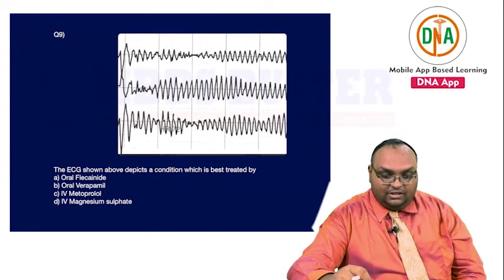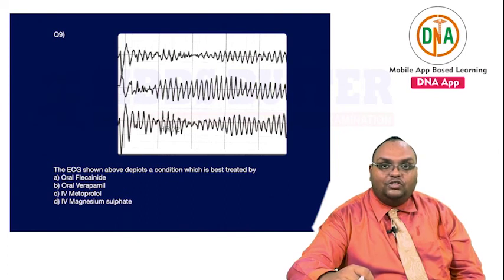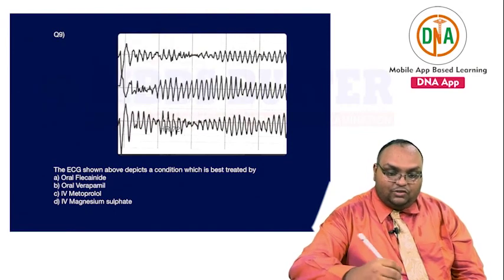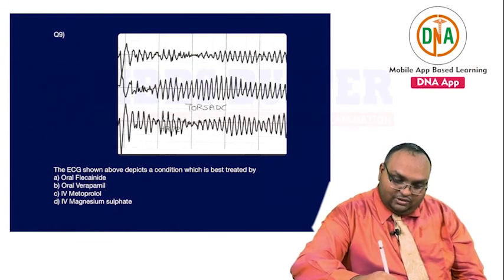So you've seen this ECG. What is this ECG all about? Yes, a ballerina dancing on the floor and her heels rubbing against the tiles, producing a pattern similar to what we see on the ECG. Any idea? A term which is not English? Yes, this is Torsades de Pointes. This is Torsades de Pointes.